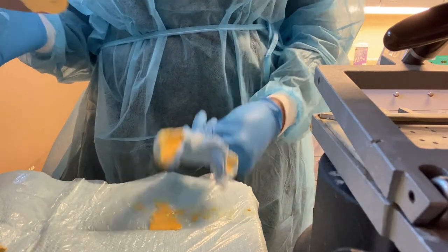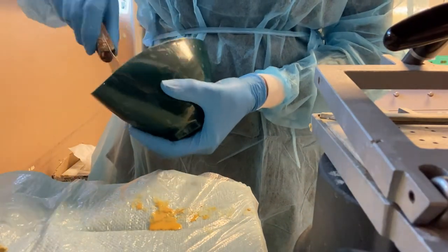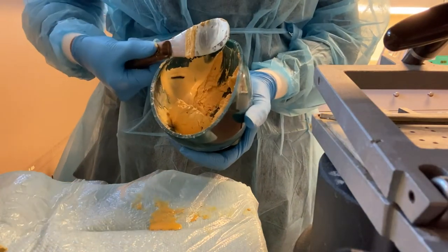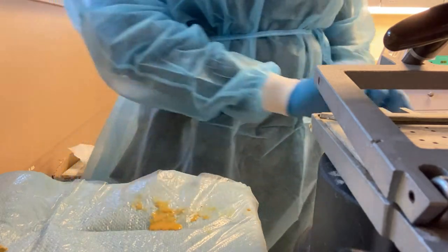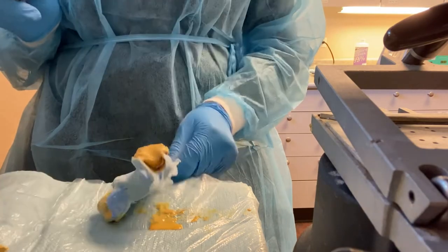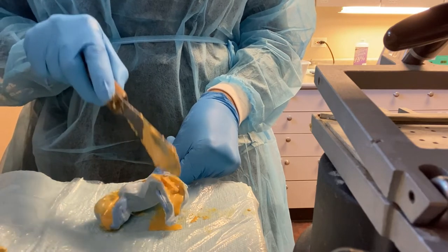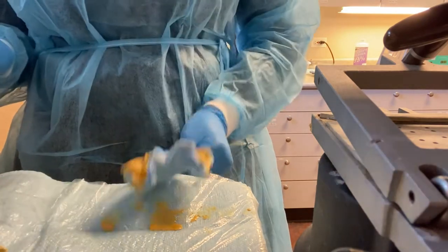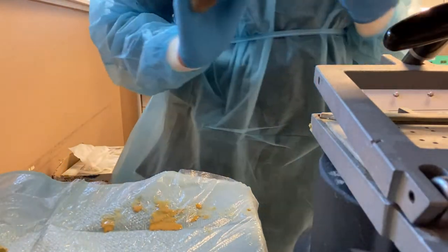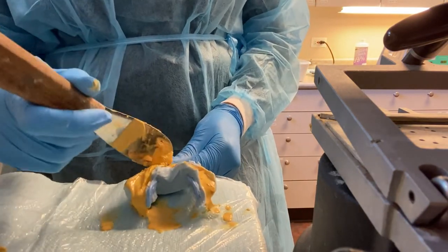Okay, so now that I've got the running part over, I made sure I got all the bubbles out. If you kind of see me sliding the spatula in the impression, I was getting the bubbles out. Now I made my base a little bit thicker. You can see by the consistency, it pretty much drops off the spatula. That's how thick I usually like my base, because even if you were to flip the impression upside down, the base is still sturdy. You can tell that it's not as runny as the first mixture, and you're not seeing it run off the edge like when I first poured it up. See, it's a lot thicker.